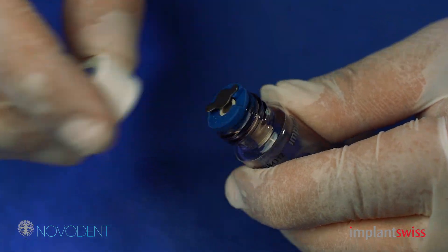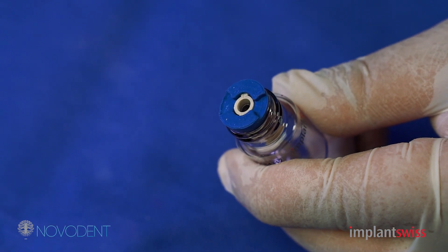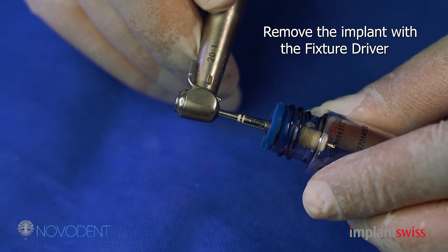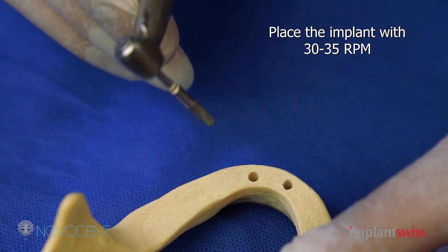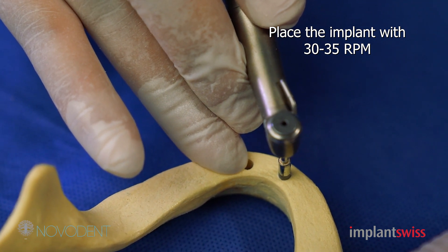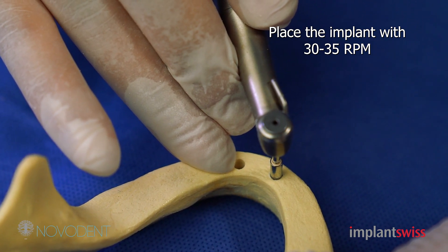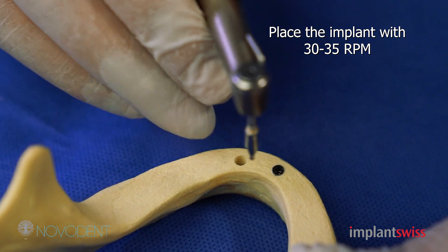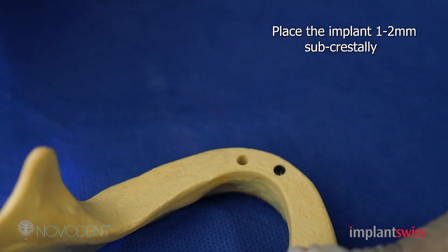You open the implant like this. You will see a metal cover here — you will remove it, and you will hold the fixture driver, as you can see here. And you pick up the implant from the vial. Then you reduce your speed to 30 rounds per minute and you start placing your implant, as you can see here. The implant is slowly going into the osteotomy until you come flush with the crestal bone, and it will stop automatically. If you feel you want to place the implant a little bit more, you can do that, until you are sure that it stopped and everything is alright.